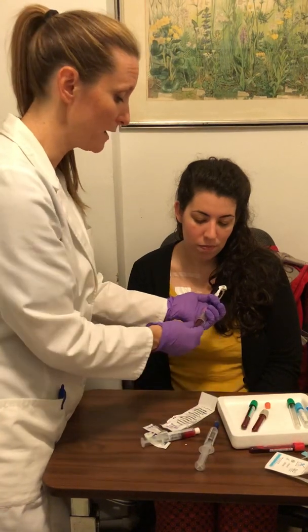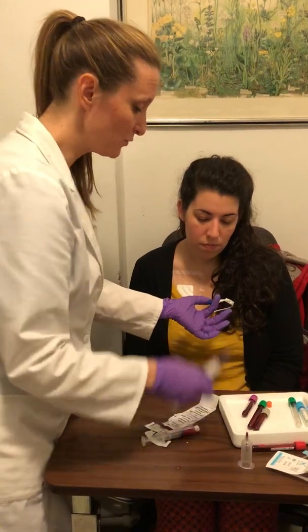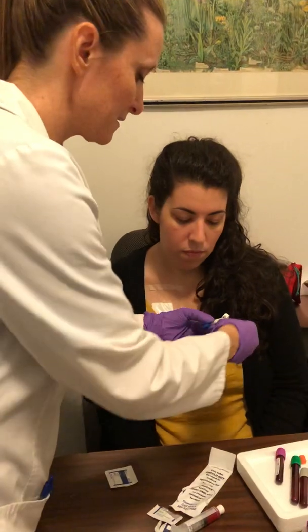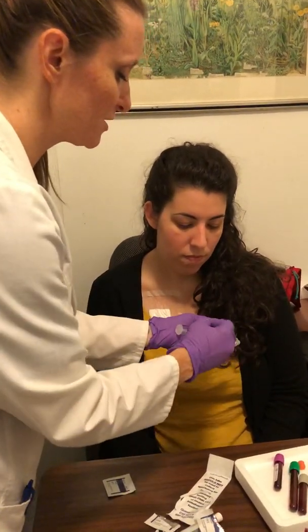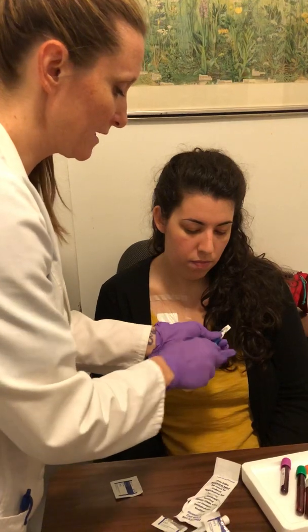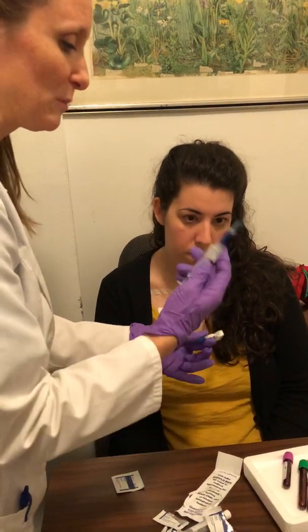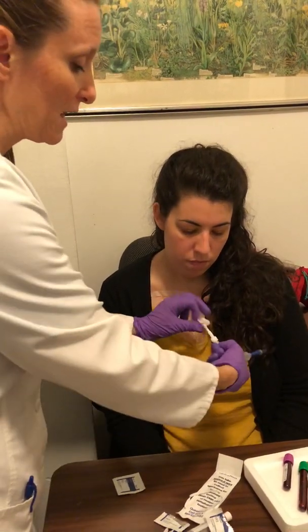Then one lavender, which is standard for CBCs or any other tests that require whole blood — then remove that. You do want to flush. Since there's a tiny bit of blood at the end, I'd like to get rid of that. I'm going to use the same flush to flush through the cap, and I want to keep it as clean as possible. Connect that and flush some of the blood out of the beginning area. Whenever I draw blood from a line, I replace the cap because I don't want any blood in the plastic pieces. Clamp your tube.